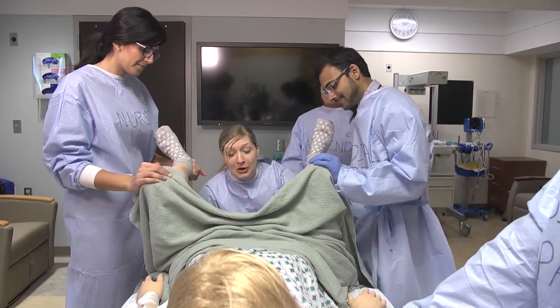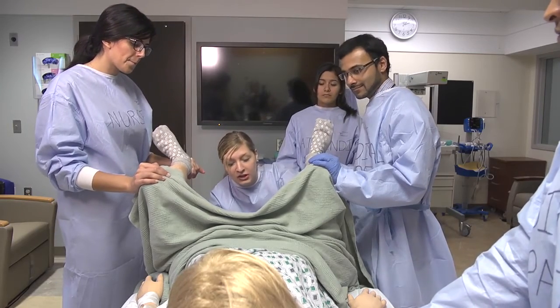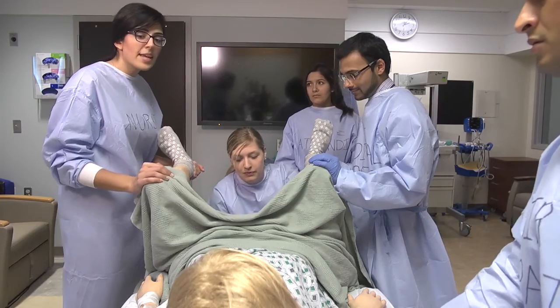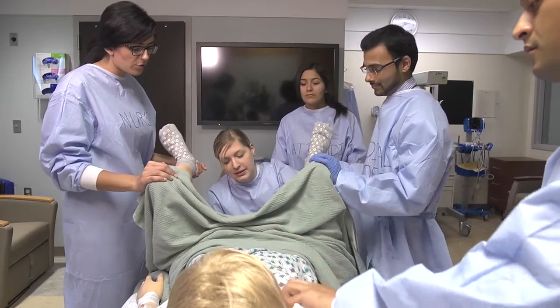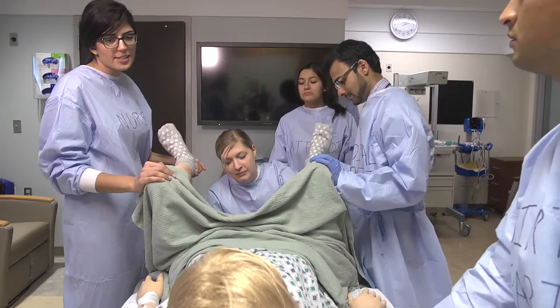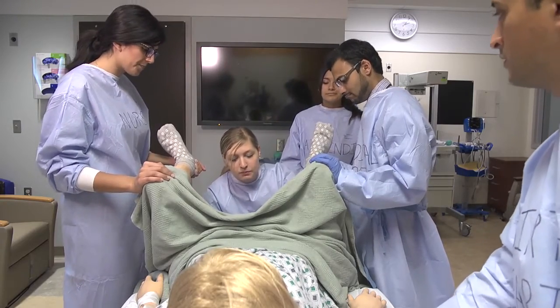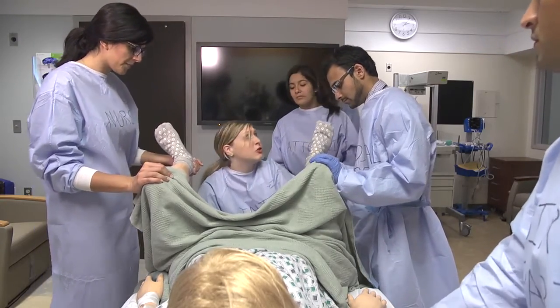Alright, Noelle, the head is almost out. I want you to push again with the next contraction, okay? Here comes the next one, Noelle. Push hard. One, two, three, four, five, six, seven, eight, nine, ten. Turtle sign. I have a shoulder dystocia.